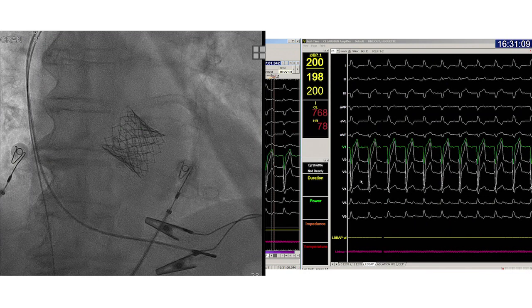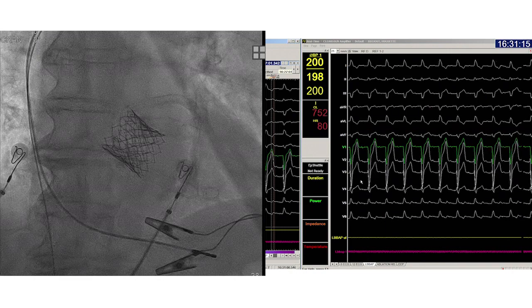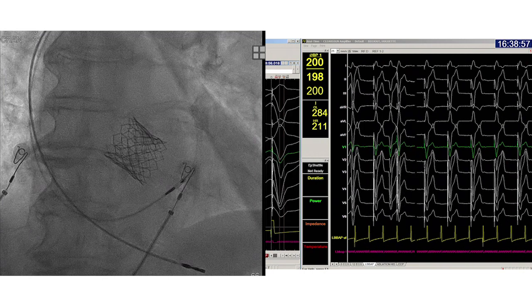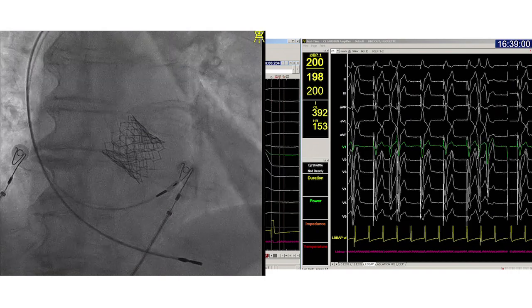In this second case with conduction disease after a TAVR procedure, some other features will be shown. Since the patient has LBBB and the guiding catheter can bump into the RV and create AV block, the atrial lead is temporarily placed in the RV to enable RV backup pacing. The guiding catheter is then advanced.